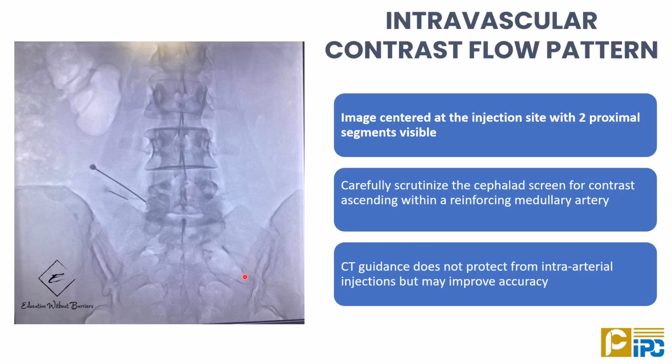Some people think that CT guidance is very safe and it removes this risk of giving an intravascular injection. In fact, that's not true. The CT guidance limits the amount of contrast spread we can visualize, because the scanning takes time and the contrast might have gotten washed away. However, it can help us to position the needle more finely. So you should do what is routine for you and what you are more happy with.